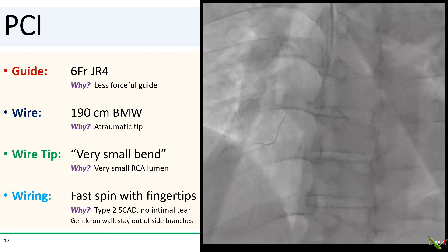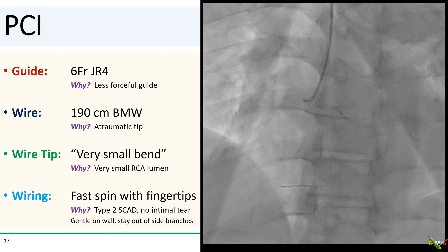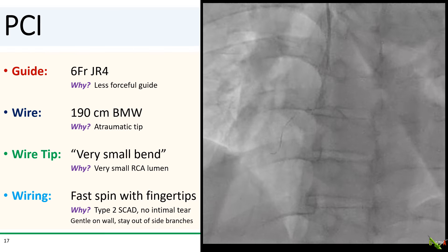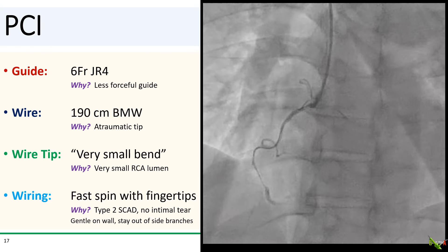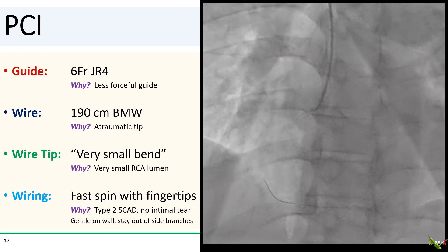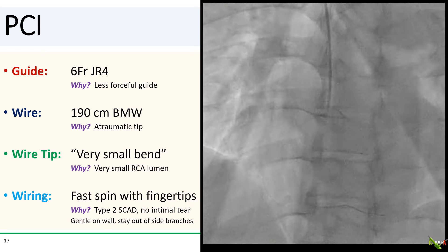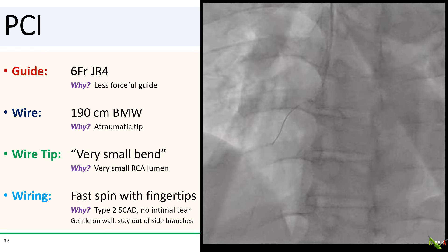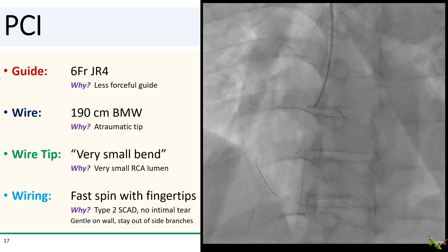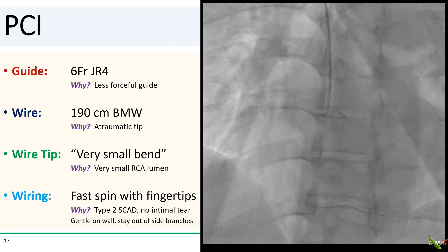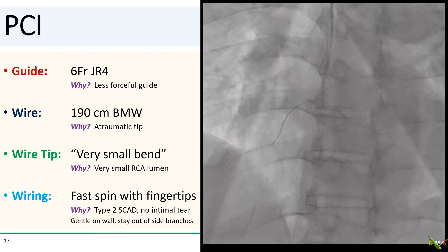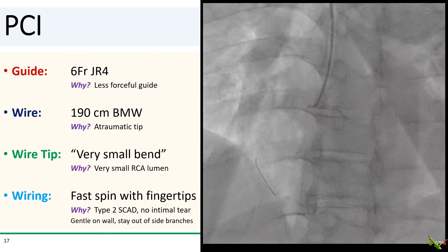I trust the laws of physics and I'm a firm believer in using torque devices, but for this situation I used the fast spin technique with just my fingertips without a torquer. The idea is to keep the tip of the wire rotating very quickly so that any force applied to the bulging intima is only for an extremely brief period of time — making the intima less likely to tear and cause a true dissection. Fast spinning also helps to keep you out of side branches. As you can see, the vessel was wired remarkably easily and we got the wire down to the PDA.